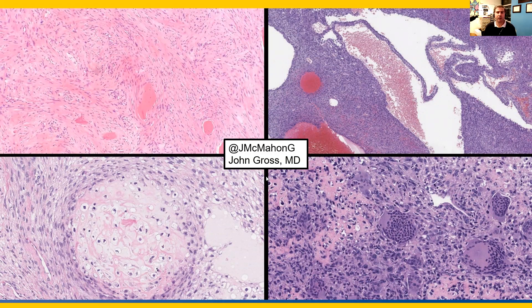At the top left is a spindle cell sarcoma that is variably pleomorphic but relatively bland — this is fibroblastic osteosarcoma. You can see various foci of more well-formed osteoid here without osteoblastic rimming.